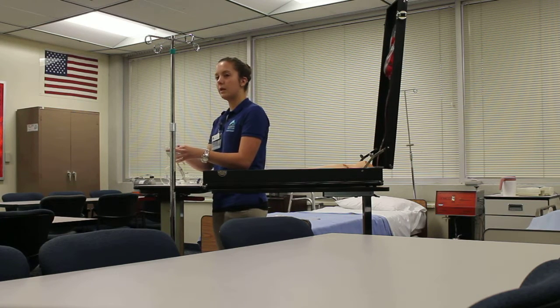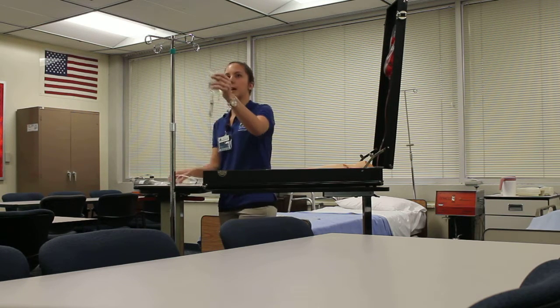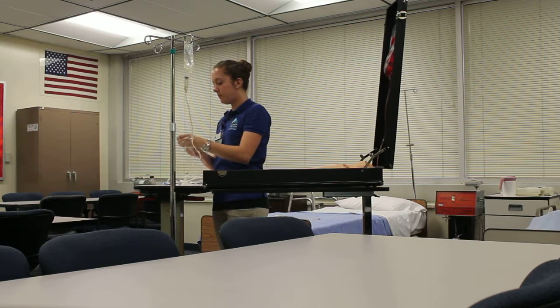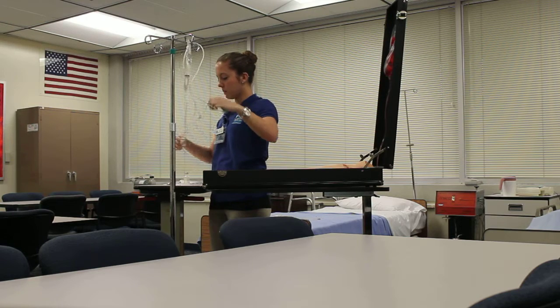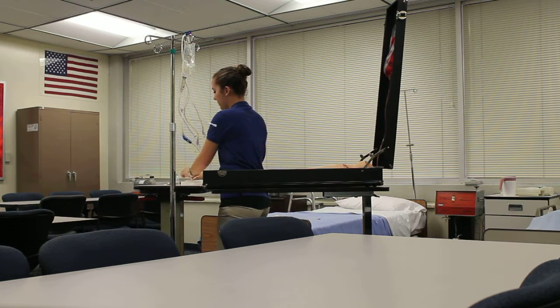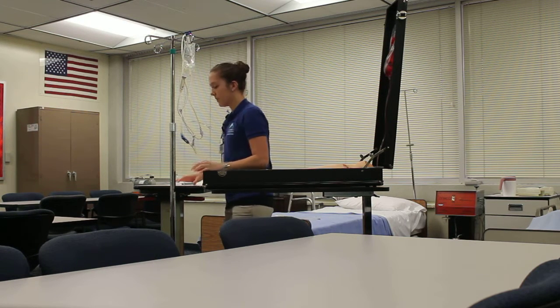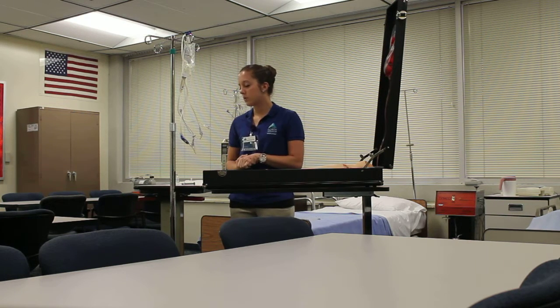I'm going to label my tubing with my initials as well as the time and date. And I can go ahead and hang my bag onto the IV pole. Okay, at this point, I have everything I need to go into the patient's room. I would knock on the door, take all of my supplies in with me as well as my doctor's orders.